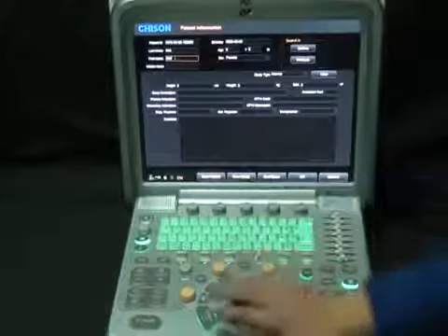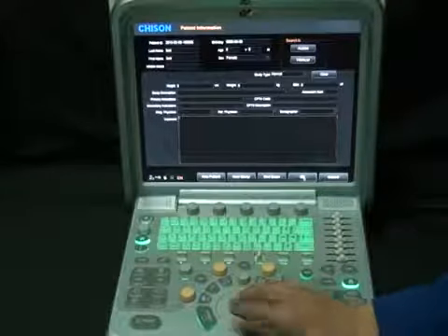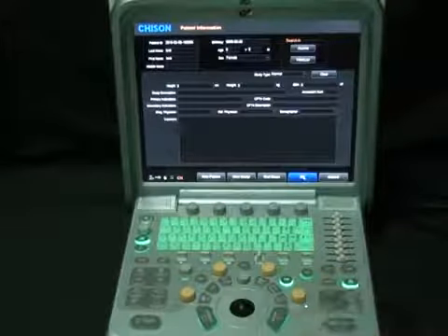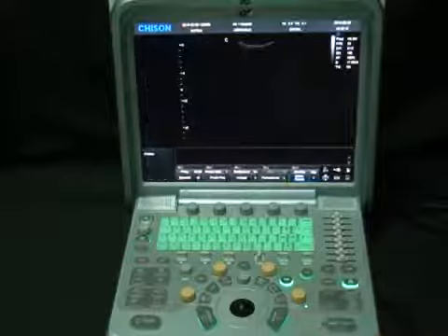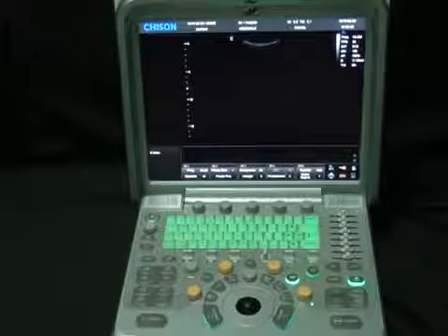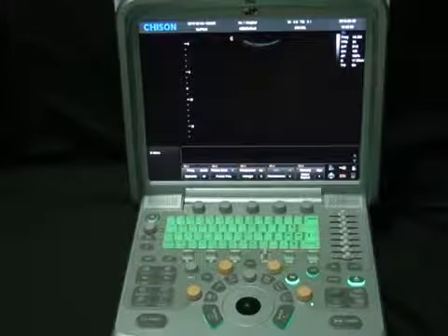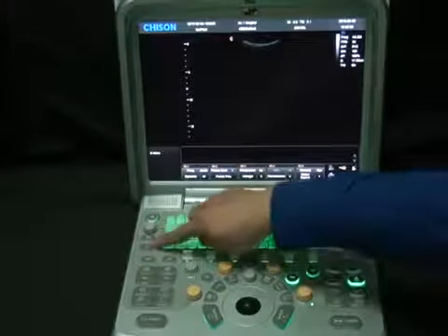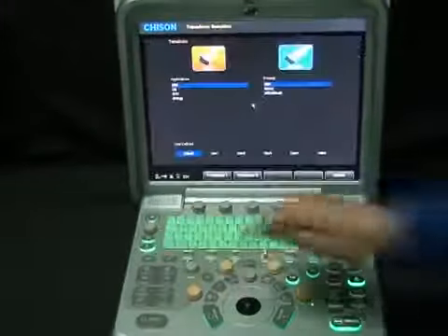When we are ready, click OK to save it. Now, to start the exam, we are going to select the probe icon.